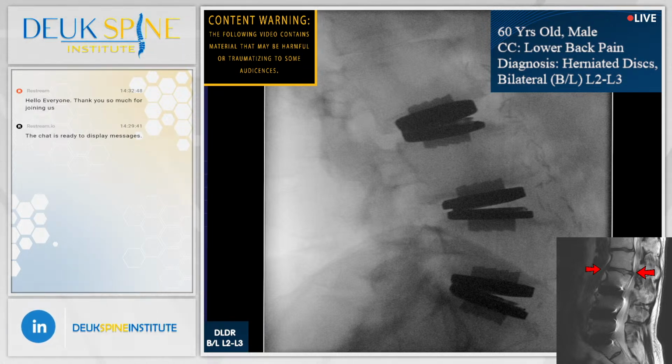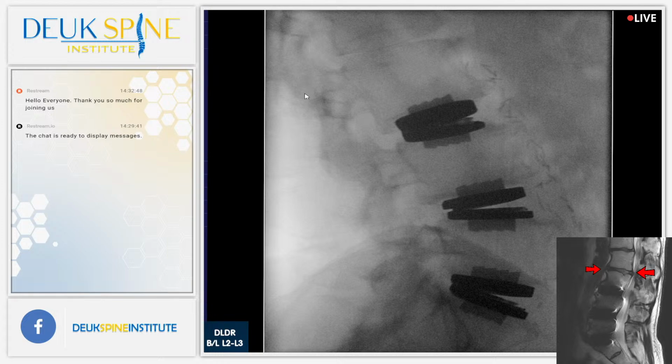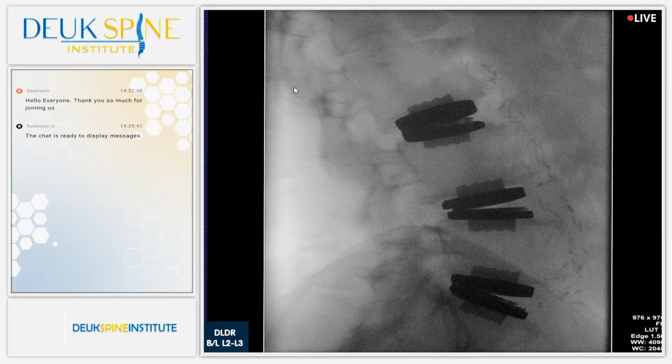In addition to that, he's got facet joint pain, and you can see his facet joints have, and look at the bone of the facet. It's darker. Here, show them that facet there, a little bit higher. Yes, that. Look how dark that is. Now go up to another facet much further up, higher up. There. Look at that facet and compare the two of them. Much darker. Those facets at 5-1 are sclerotic, meaning that there's some instability, there's some enlargement of the bone, thickening of the bone because of Wolff's law, which says that stress will cause bones to thicken.